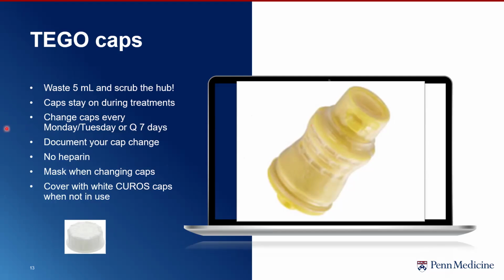A lot of our CLABSIs throughout the hospital system, at least 50% have been related to dialysis lines. So having the documentation of the valve change is really important when I go back and look to see what may have contributed to a CLABSI. There is no heparin in these; they're not heparinized, and you really do want to make this a sterile procedure when changing the caps. At least use a mask, and then you cover these with the white caps when not in use.